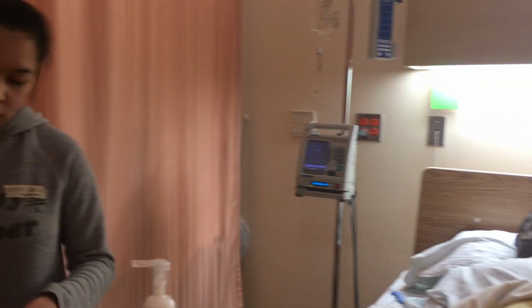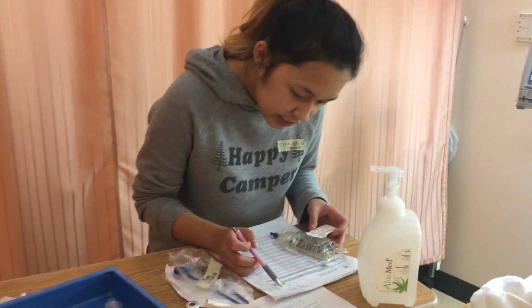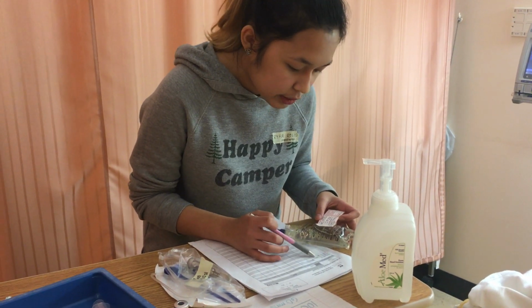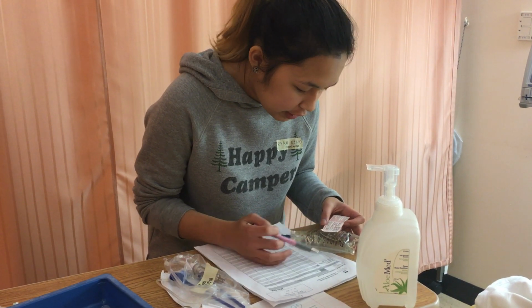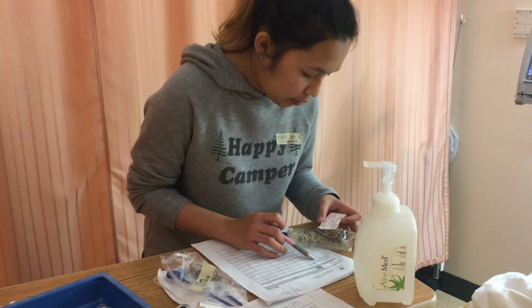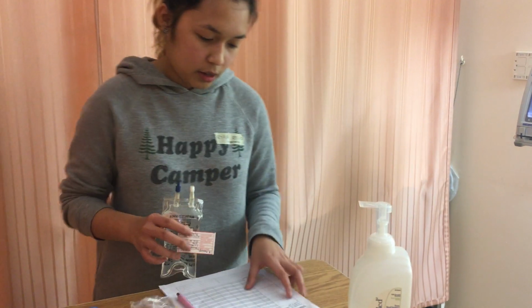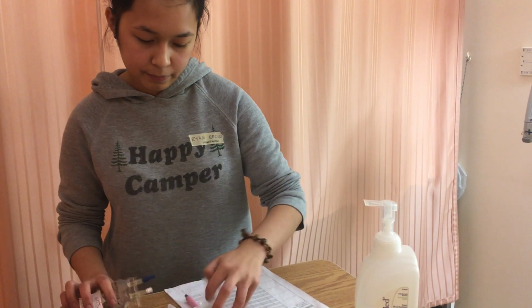At this time, I'm going to do my third med check. So this is for Regina Phalange. She has no known allergies, and this is the penicillin G sodium, 3.5 million units, to be given IV every 4 hours. Time right now is 1800. So I am going to grab my tubing.